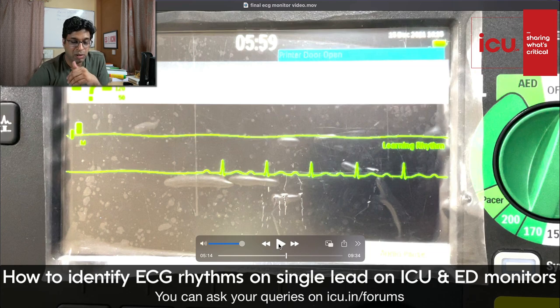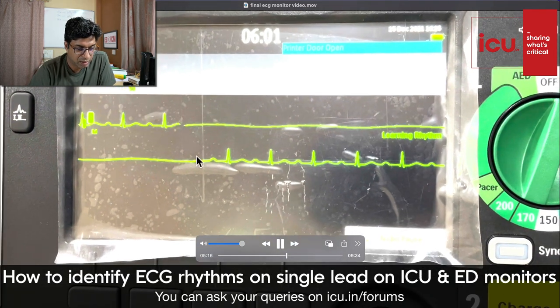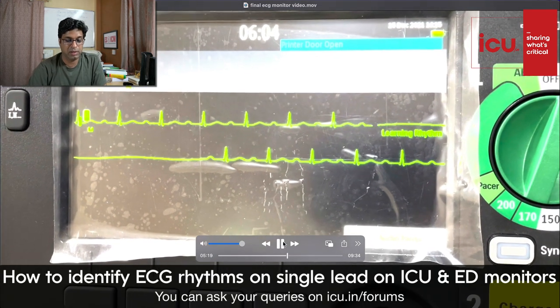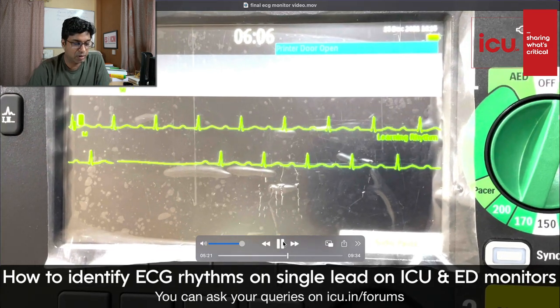First degree block. So the P wave is generated from the SA node going to the AV node. A little bit of delay is there. Nothing else. So it can be a normal thing. Nothing needs to be done. So it's a first degree block. You see, the PR interval is prolonged, but it's constant. Earlier the P wave used to be here, but now the PR interval is prolonged. So it's a first degree block. Not to worry about this.